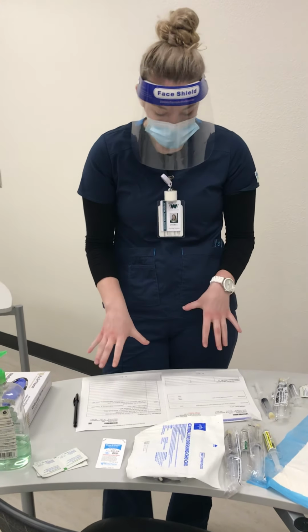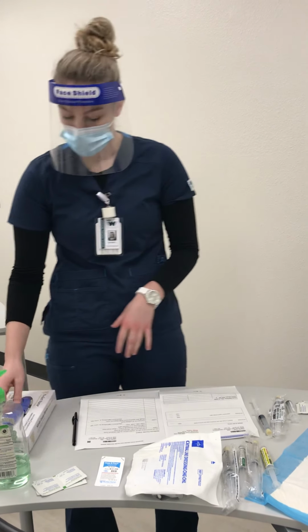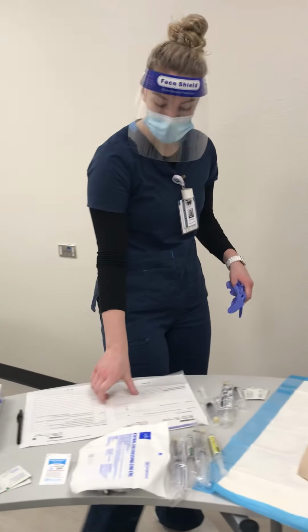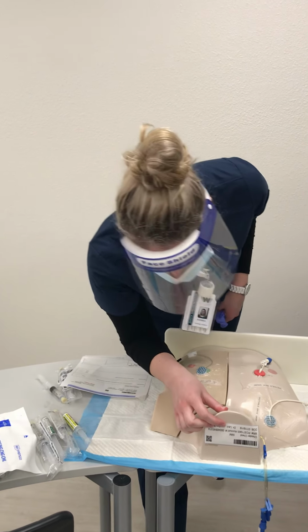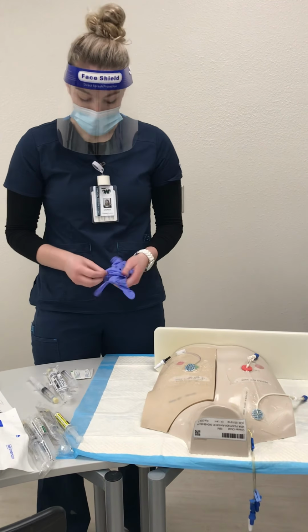So once I verified my healthcare provider orders and my MAR, I'm going to perform hand hygiene again and enter my patient's room. Hi there, can you confirm your name and date of birth for me? Chester Chest, 7/19 of 19. Okay, and that matches. Okay, Mr. Chest, so today we have a few procedures today.